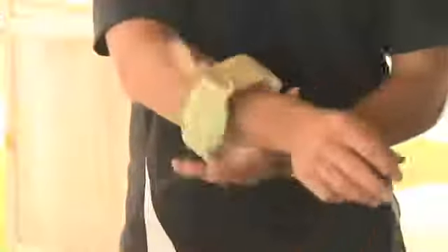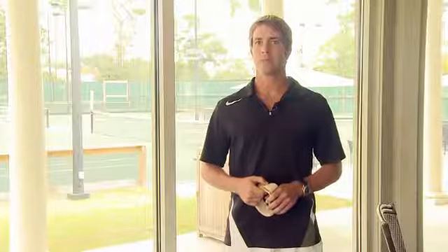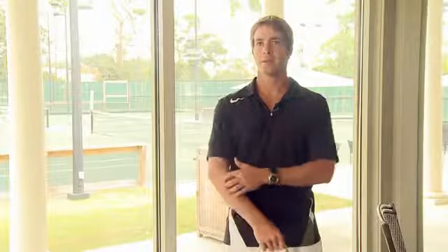Hi, I'm Rob Ferrer. I'm a USPTA certified tennis professional and today I'm going to be talking to you about how to wear a tennis elbow brace. Tennis elbow braces are used for minor strains to the elbow tendon or muscle.